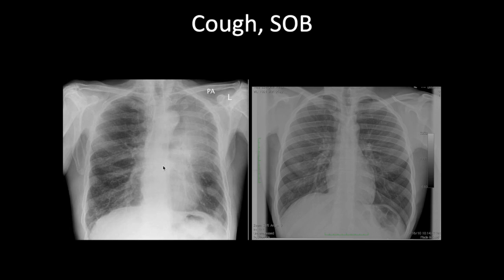This is left upper lobe collapse. When the left upper lobe collapses, it collapses onto the left heart border. There is airspace opacification with no air and no lung markings — it obscures the left heart border, confirming it is in the upper lobe. The trachea is pulled slightly to that side, the aortic arch is pointing toward the left side rather than being straight up, and the left hemithorax looks smaller than the right. This is collapse of the left upper lobe.